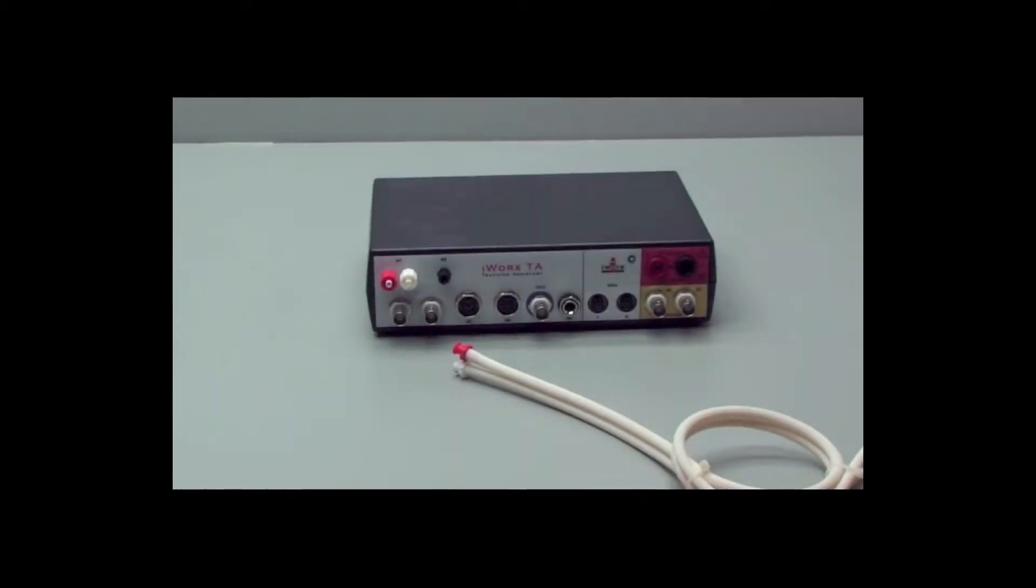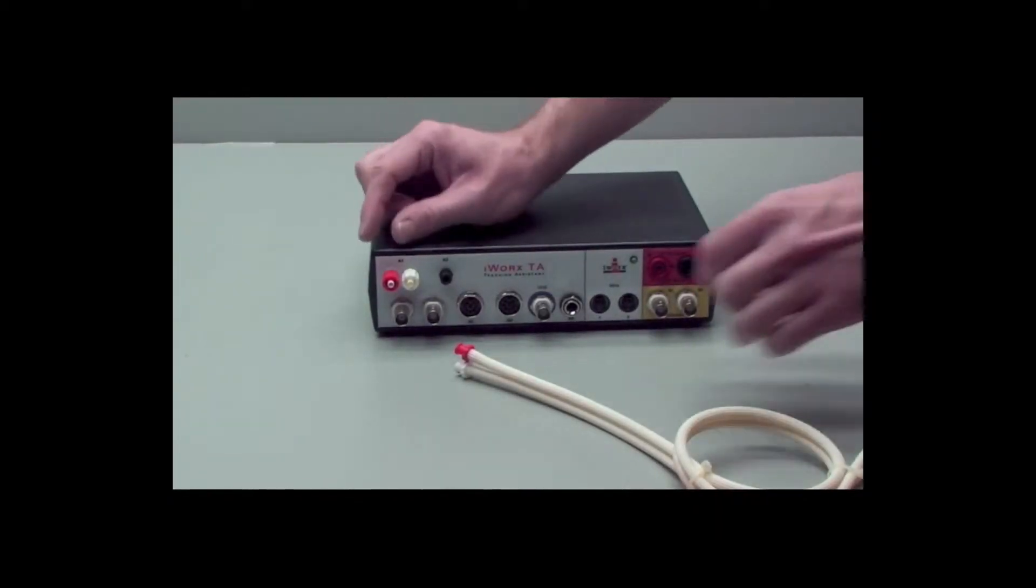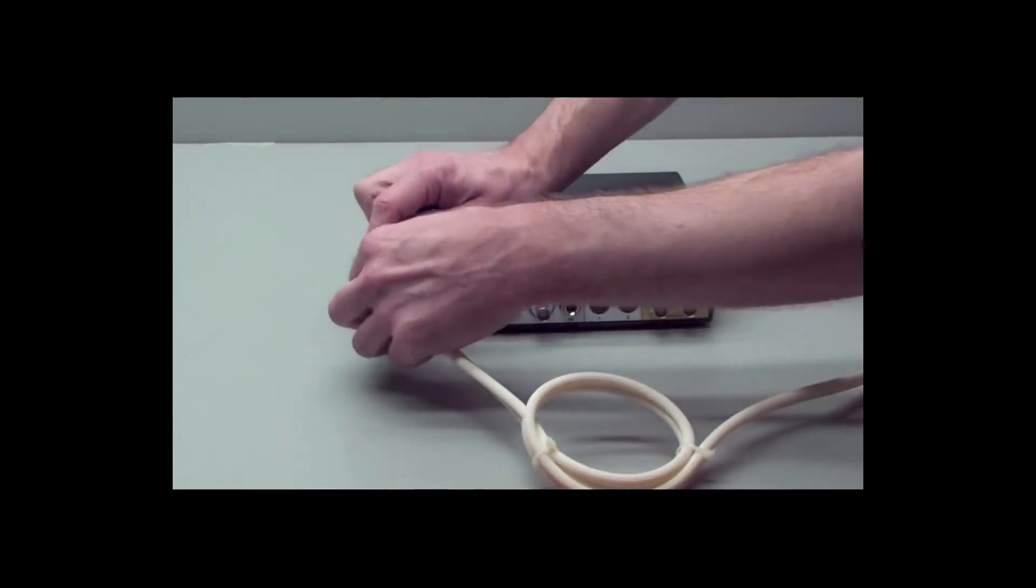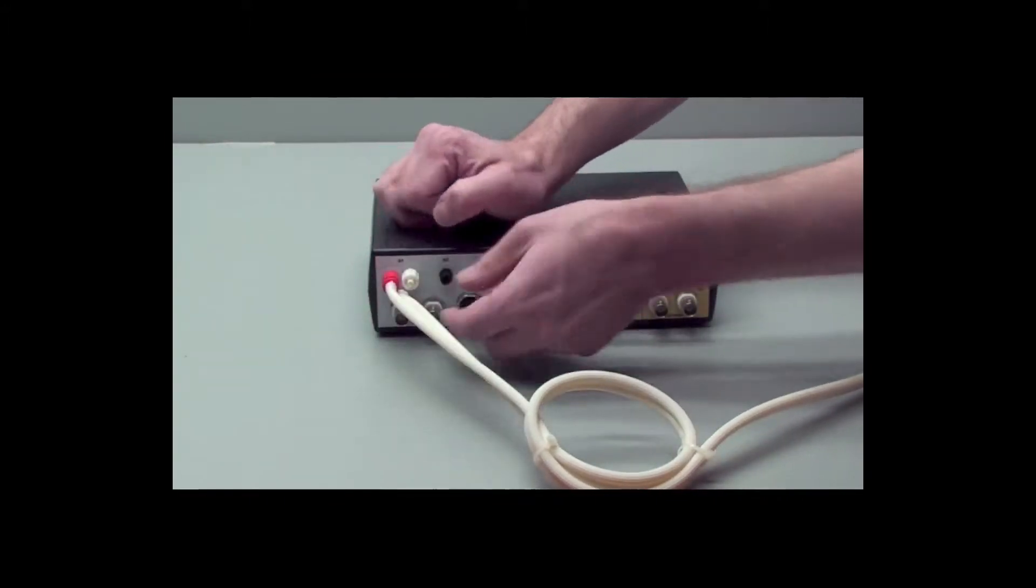Take your flow head tubing, and red goes to red on the front of the TA, and white goes to white.